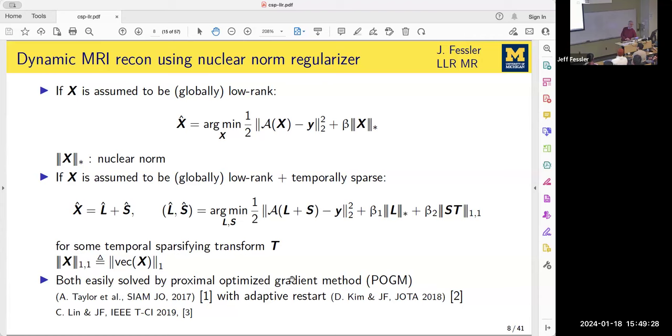So why do we assume an S here, sparsity? It's similar to robust PCA. You're assuming that the model has some low rank component and some sparse component. And the noise, that's correct. So the noise is this difference right here. In the robust PCA literature, you have different formulations, some of which involve an equality constraint here. And we don't want any equality constraint in MRI because there's definitely noise in the data. So the noise is here, the low rank is here, and this is the sparse signal components that I'm interested in here. Of course, there's a further extension that maybe you discussed in 559. If you thought there were outliers in the measurement process, maybe you'd replace this two norm with a one norm, right? Or something like that. But at this point, Gaussian noise is a very reasonable model. Okay, does that answer your question, I hope? Yeah.